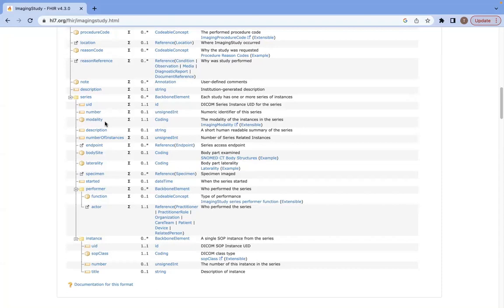Modality. Now, remember that in DICOM, modality can vary by series. It's at the series level because you can have a study which has, for example, both PET and CT in it. Description is series description. This is another field which contains a lot of human error. It's a text field, but sometimes, again, it can be really useful, and sometimes it's all you have to go off of to know which particular series to pick up.